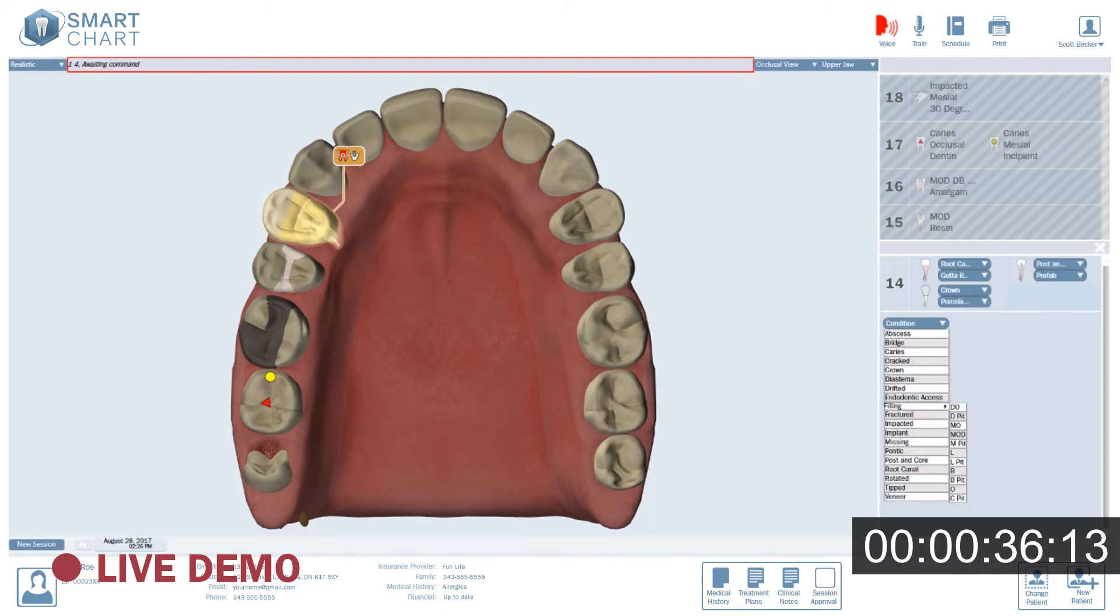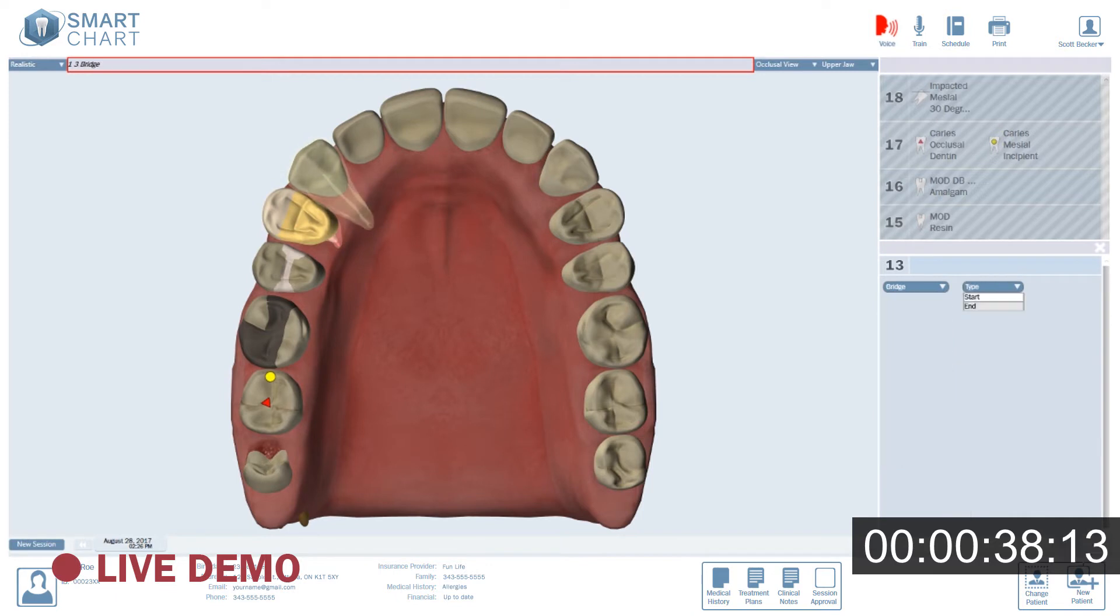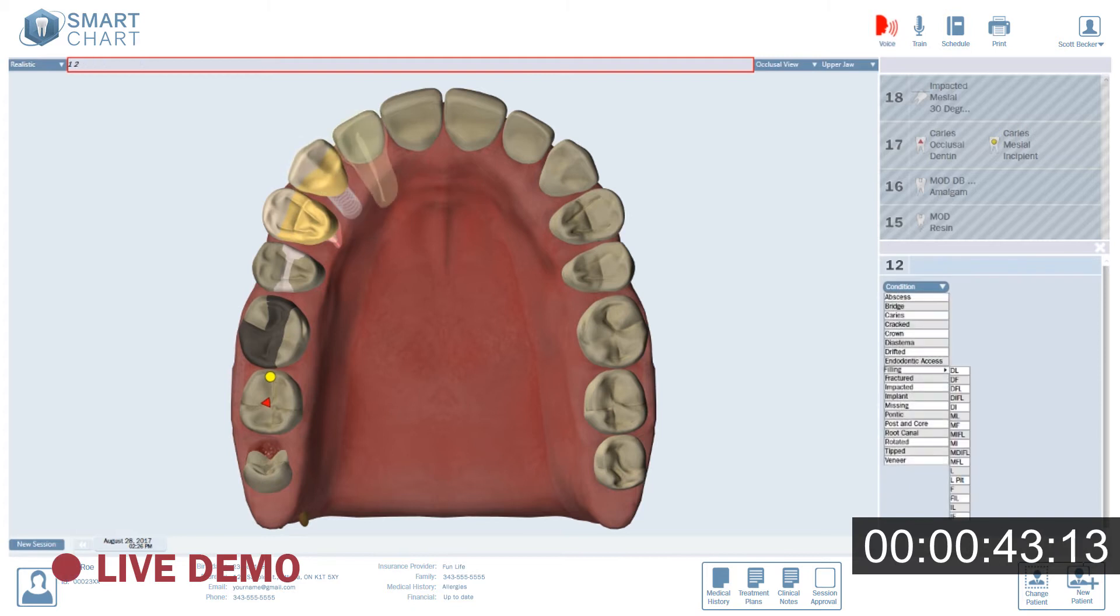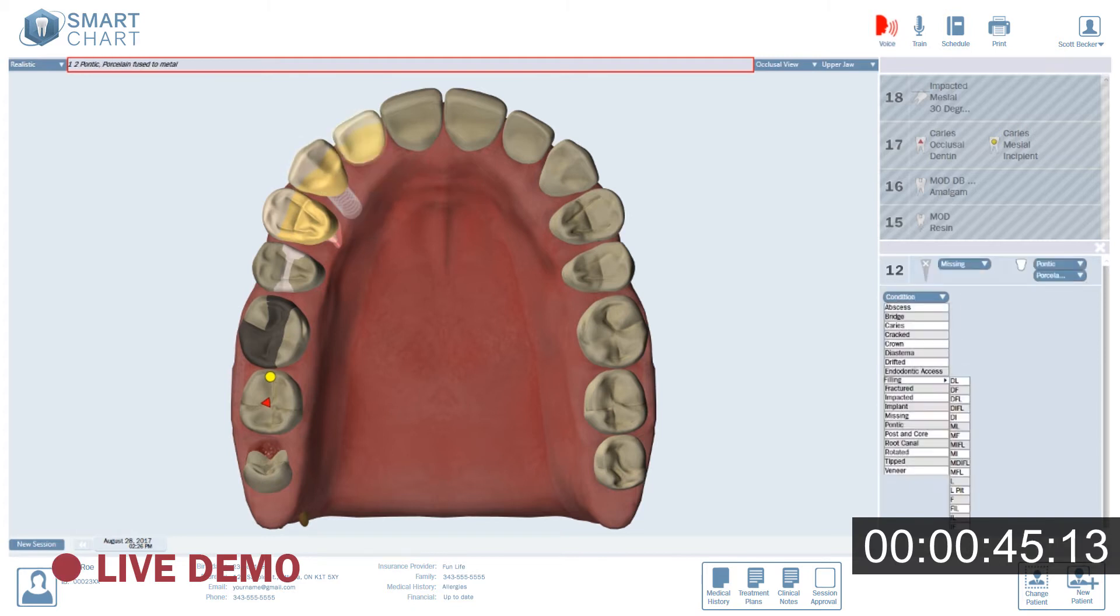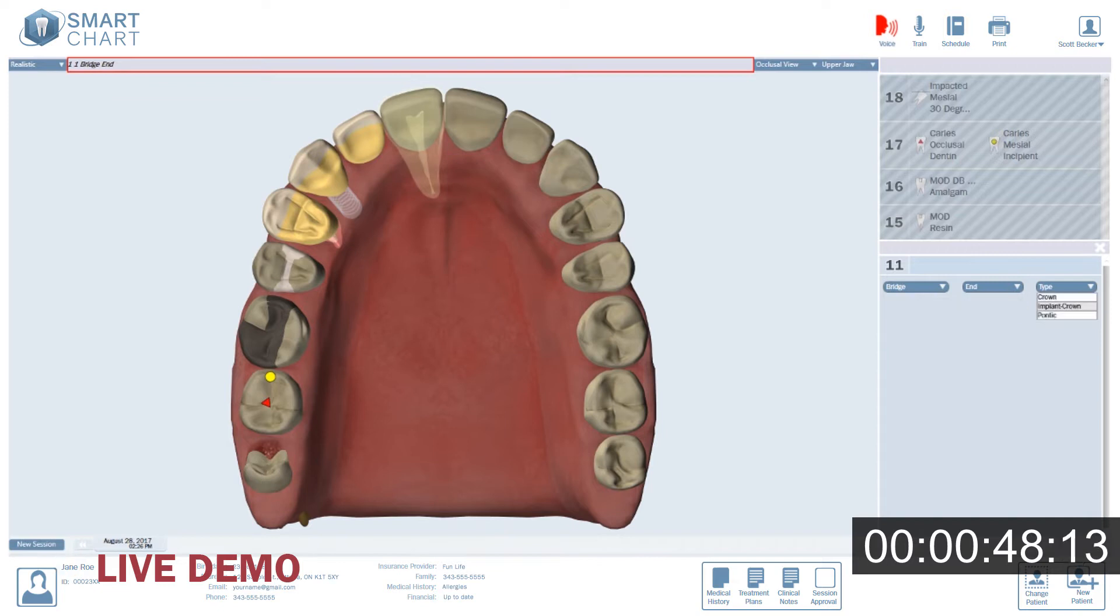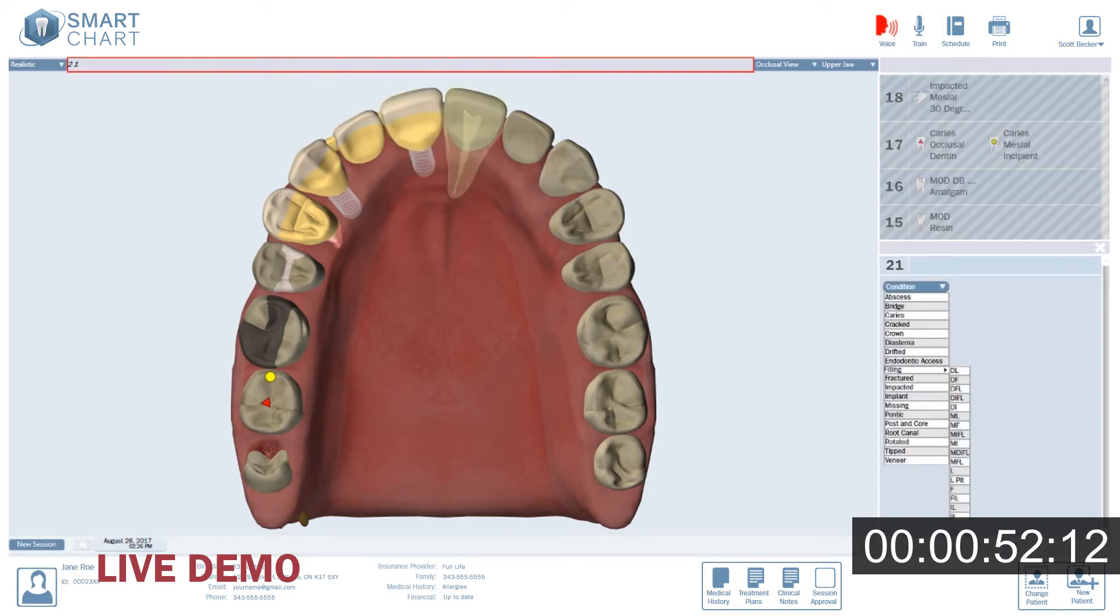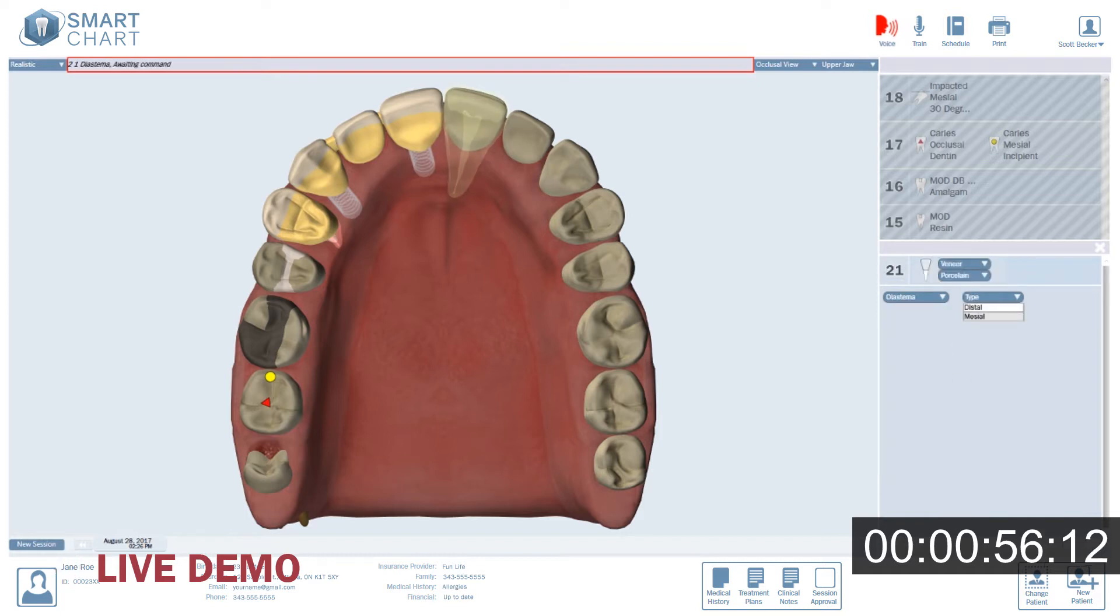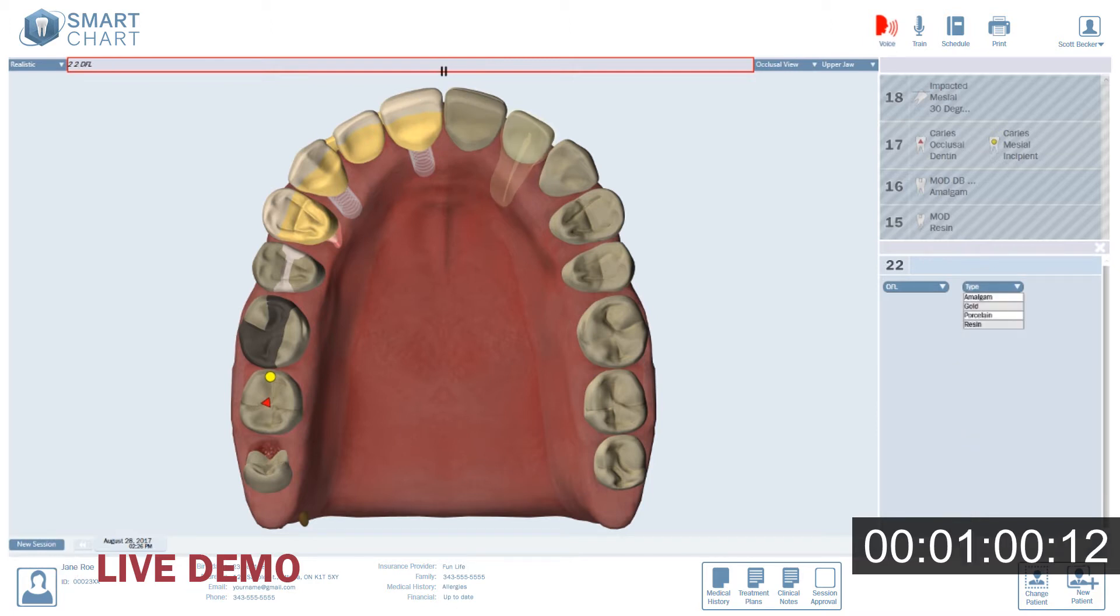1.3. Bridge. Start. Implant crown. PFM. 1.2. Pontic. PFM. 1.1. Bridge. End. Implant crown. PFM. 2.1. Veneer. Porcelain. Diastema. Mesial. 2.2. Distal facial lingual. Resin.